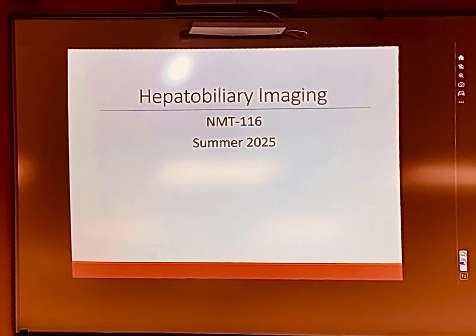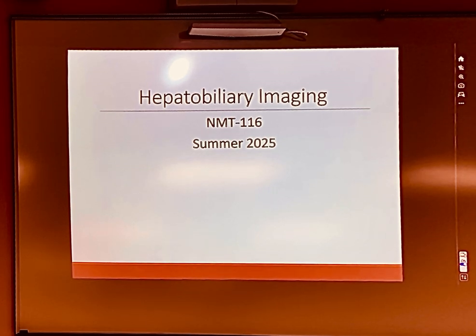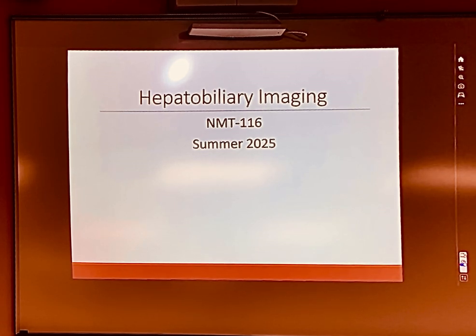So when you're doing hepatobiliary imaging, when you inject, you're going to inject an IDA compound of a dose range, and you're going to see liver immediately, within a minute or so. By the time you get the patient out of the chair and on the bed, liver is there. And then you're going to see that the hepatocytes in the liver are actually going to process this IDA compound, and it's going to follow the same process that bile does.